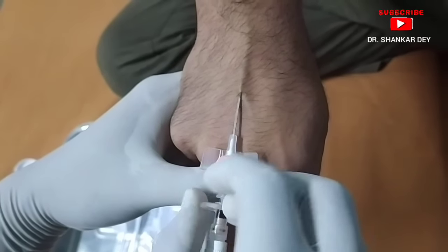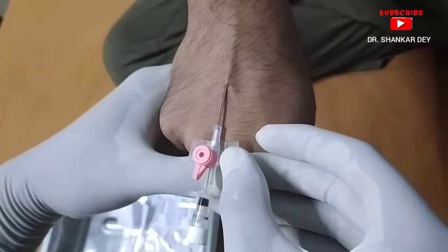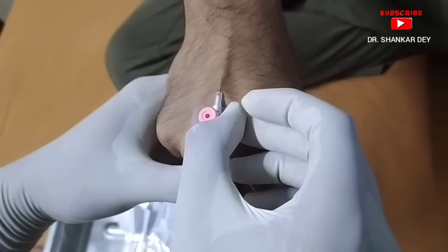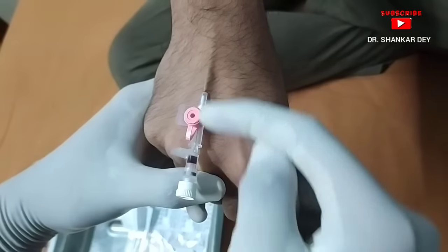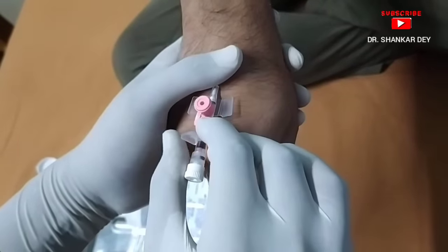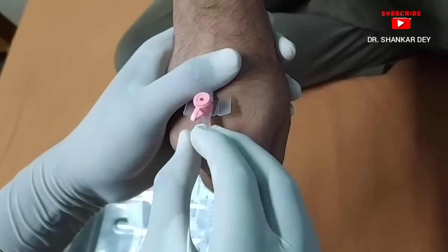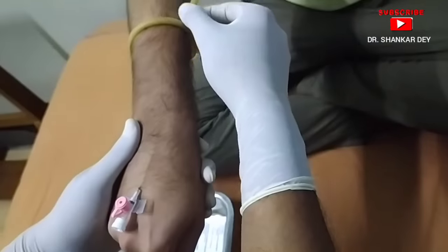Now the needle is withdrawn slightly. Then advance the IV cannula further into the vein. Now the cannula is introduced. Remove the needle and close the distal end of the IV cannula. The introduction of the IV cannula is complete.